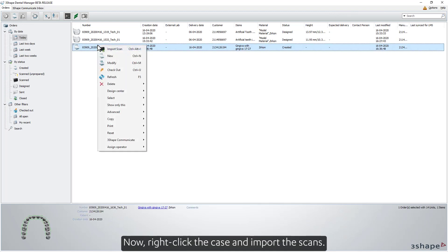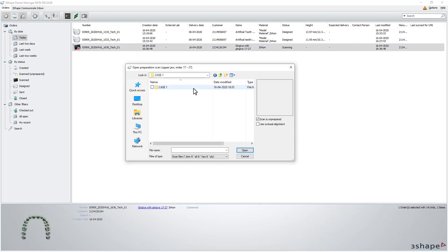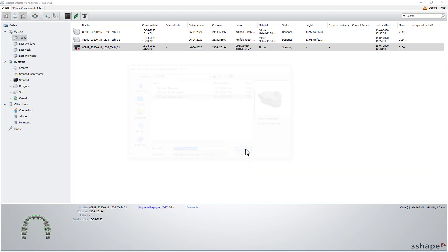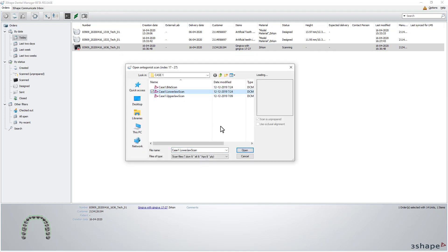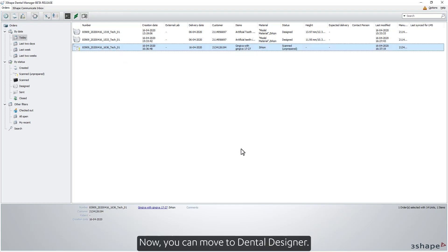Now, right-click the case and import the scans. Then you can move to Dental Designer.